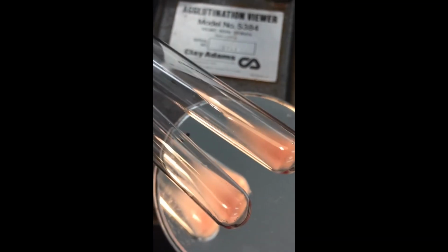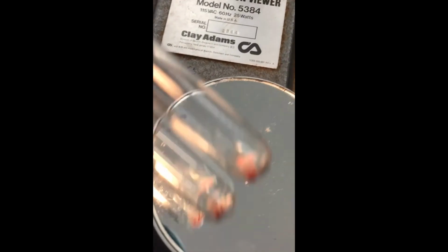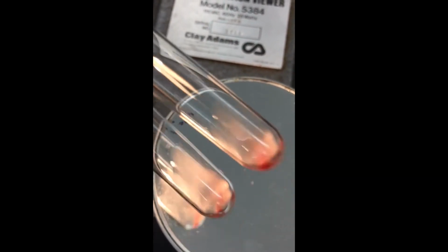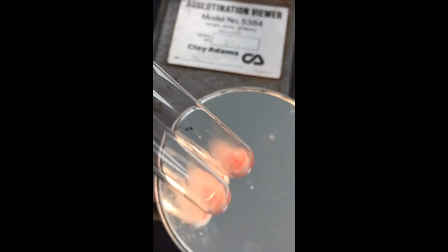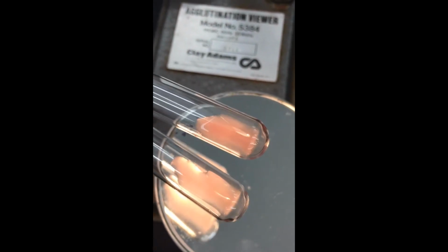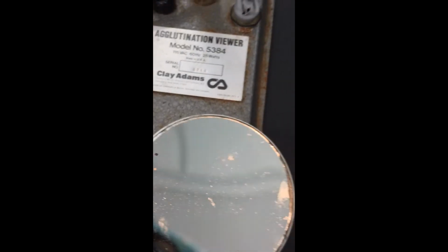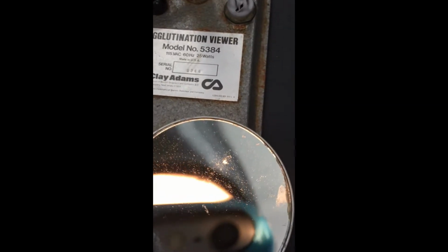Okay. AHG. 7 and 8. Seven is on the bottom or the left. 9 and 10.